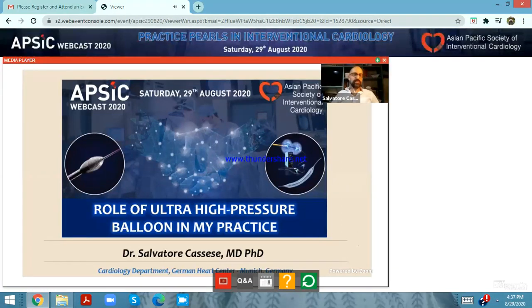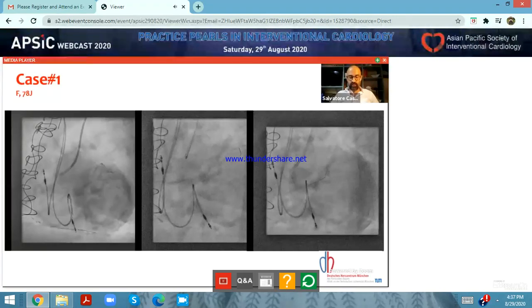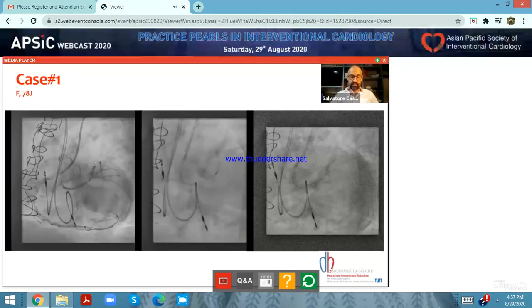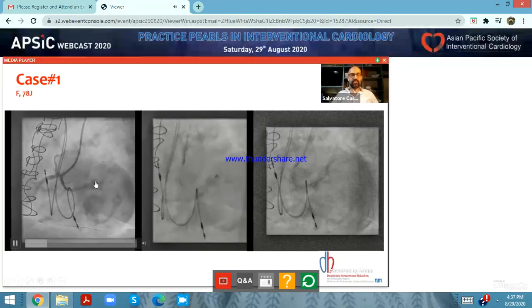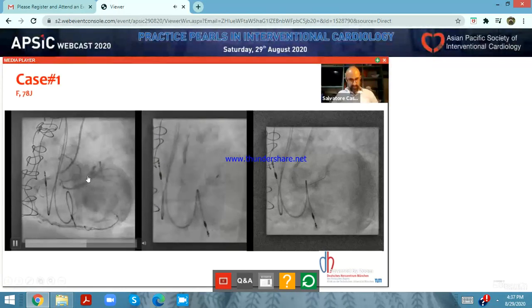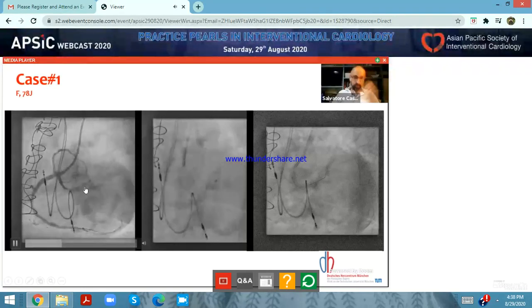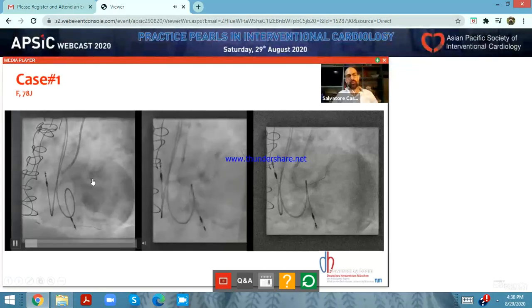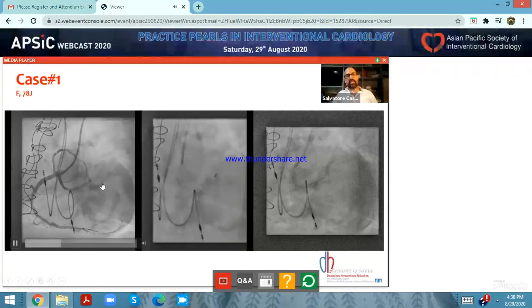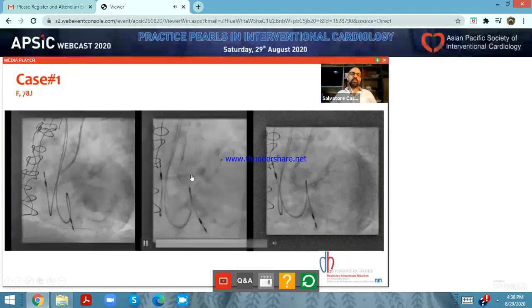And I will start for the audience with something that is going to remain in our heads more than a lot of words. This is a common ostium of a lady that presented at our institution with a tight and very calcified, this horrible stenosis the professor referred to. And the lesion was placed on the distal left main, if we can call this left main, and it was extended in the LAD and on the left circumflex. As you can see, there was an extensive rotablation.